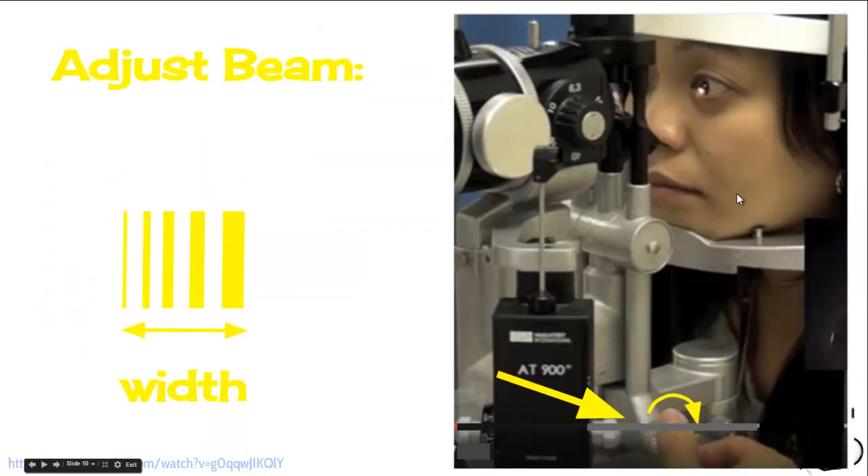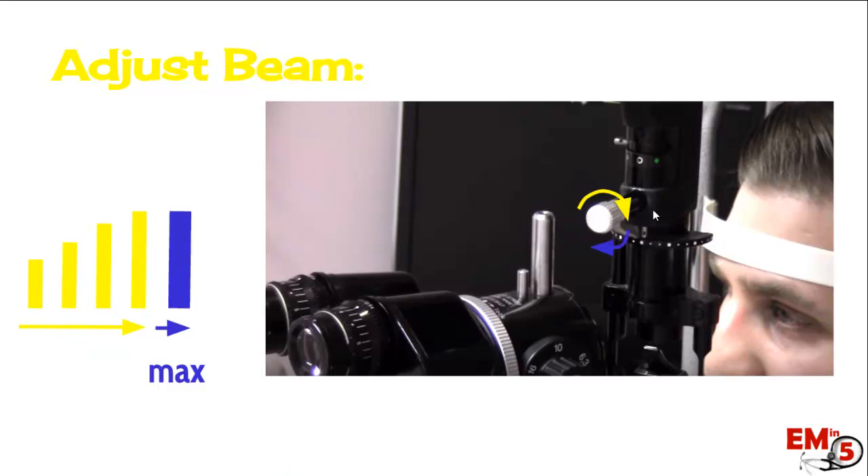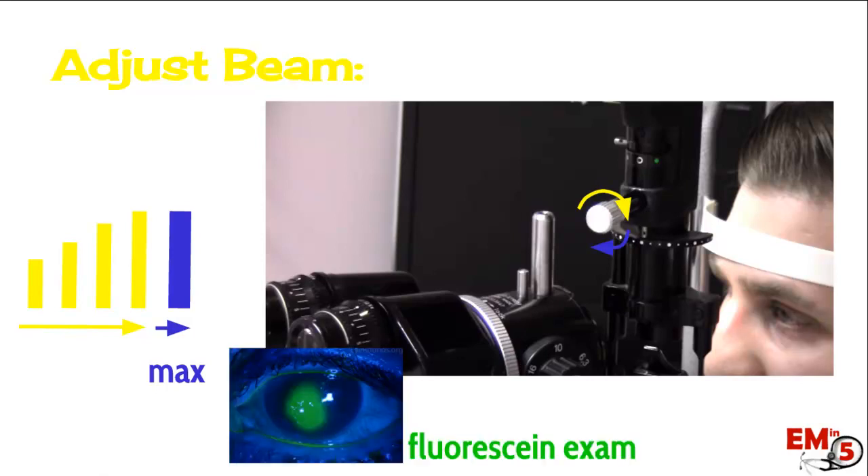Next, there are a bunch of different adjustments for the beam. For width, this little dial down here lets you make the beam more narrow or more wide. You can also adjust the height of the beam — this dial or switch is usually up on the top of the machine. As the beam gets larger and larger, there will be a little click, and you'll max it out and the beam will suddenly turn cobalt blue. This is really important because this is the blue light you need for a fluorescein exam. So remember, the same switch that controls height — maxed out — is where your cobalt blue light is.